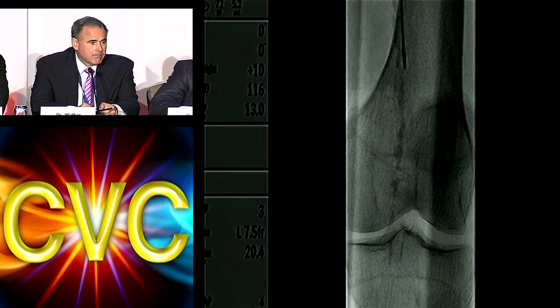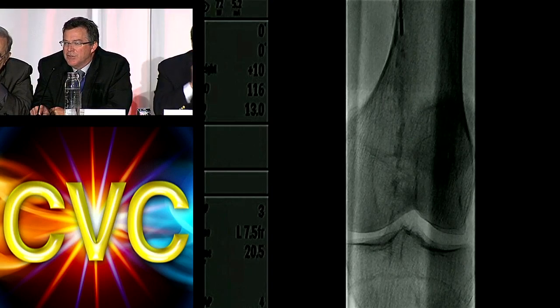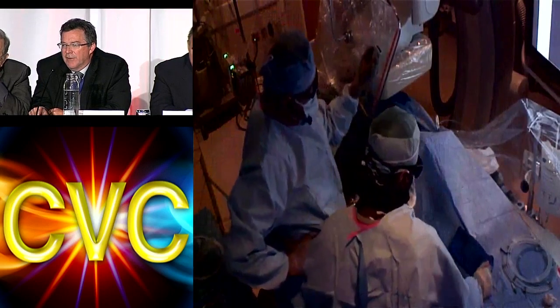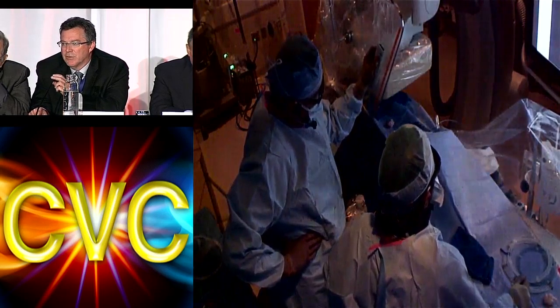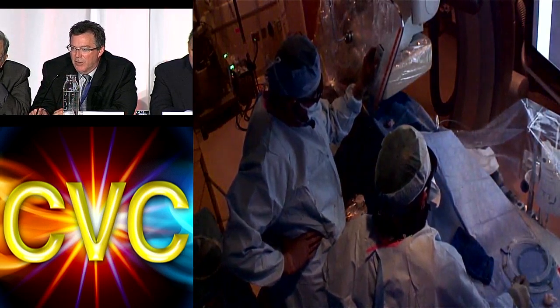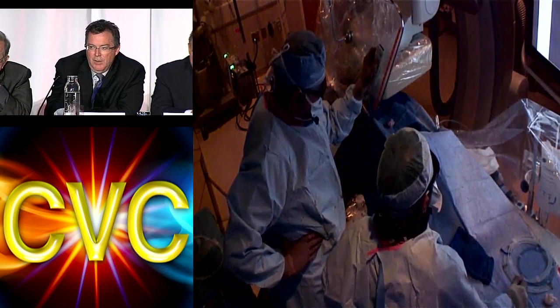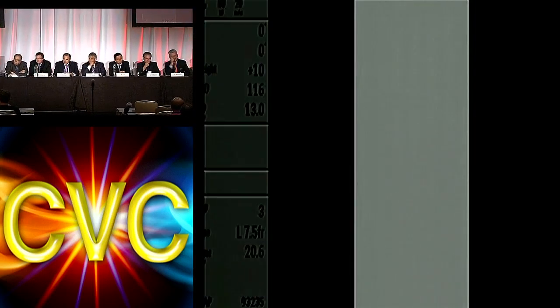Jack, is there any way you can get us a lateral view or off-angle view? Because it looks like that may be a geniculate branch coming there, and you may be actually getting into that, because as I'm watching your Wildcat go down there, it almost looks like it's going lateral to that calcium. And so I'm wondering if that's actually a branch that you're getting into. So maybe you can take a lateral view for us, or LAO-RAO view, just to see if we can get that off. I was thinking the same thing, because it completely follows without any effort past our calcium. So I was going to go back and look when we had a little better picture.